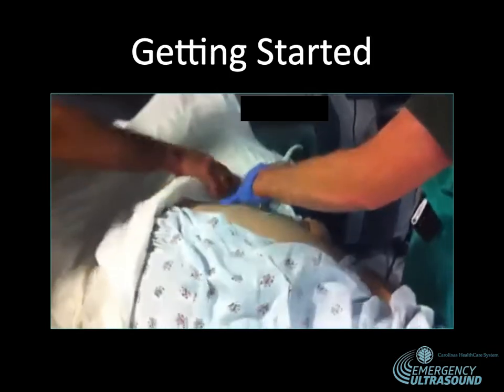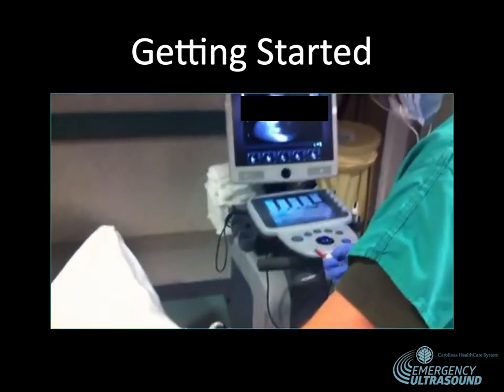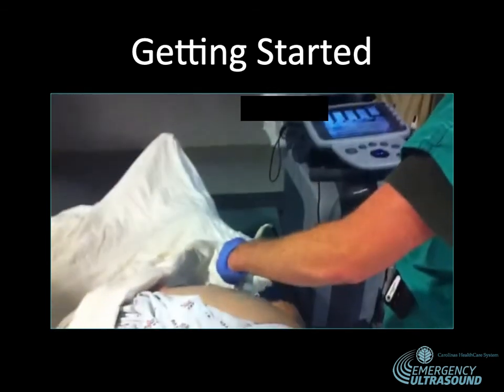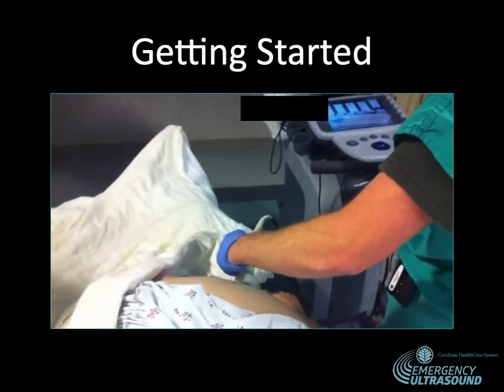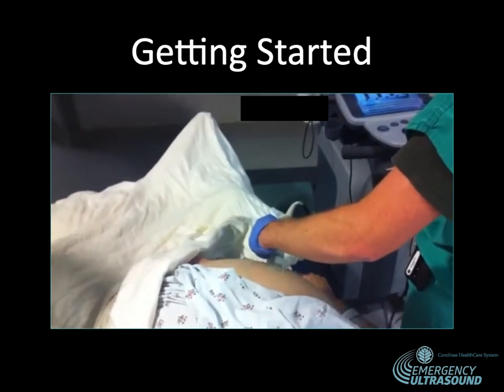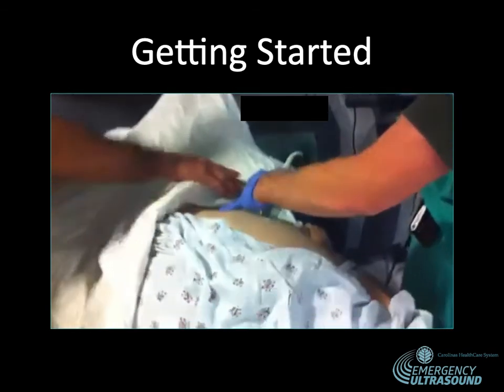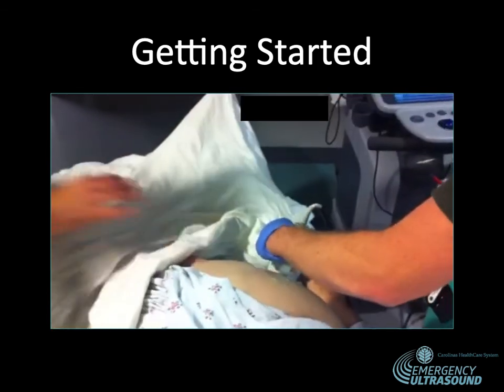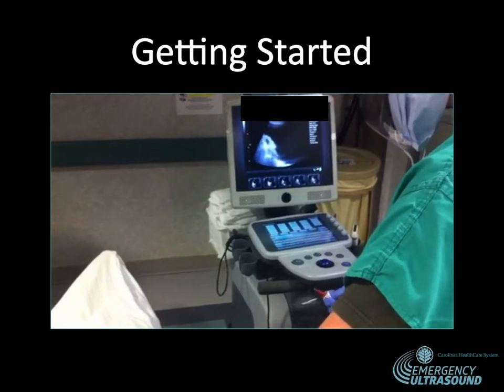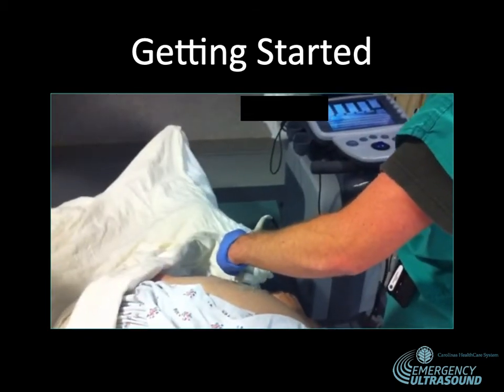So getting started, we're looking here with ultrasound in real time. We have sterile gloves on, and you can see that pocket right there. We see a bowel just floating in a large anechoic fluid collection. We want to assess the best pocket below the umbilicus with ultrasound. We're going to make sure that we are not above the umbilicus because we want to make sure we avoid the spleen and the liver.